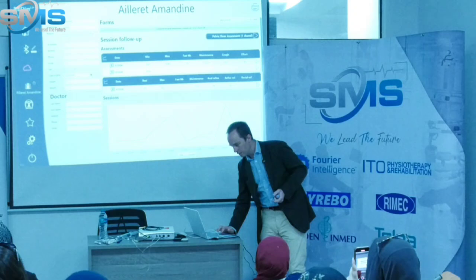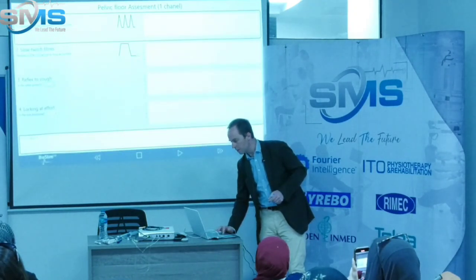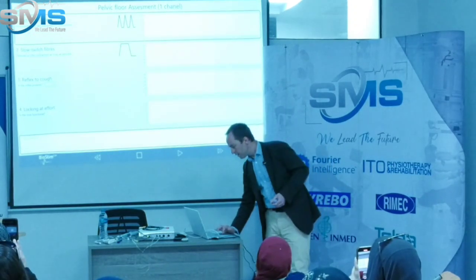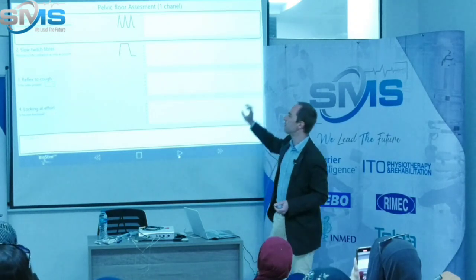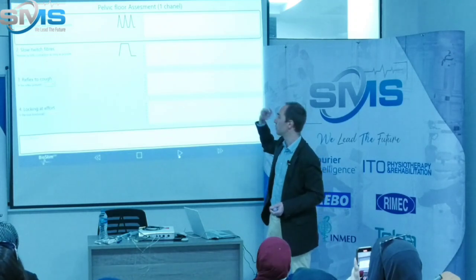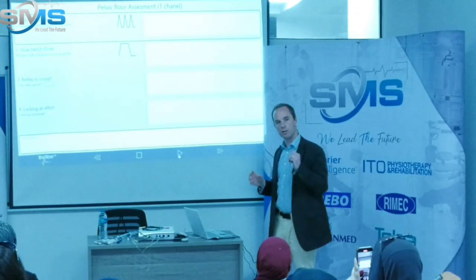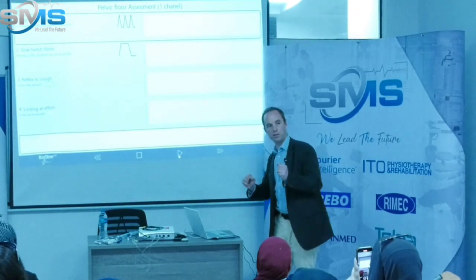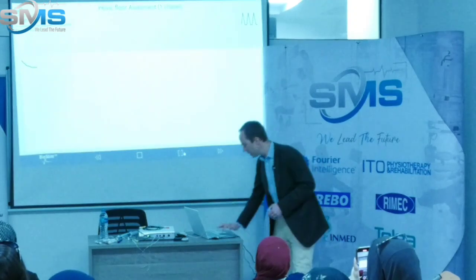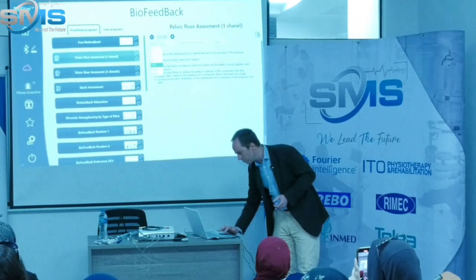so now I can start to work with my patient. So the first thing we'll do is an objective assessment. You can see it's very easy. It will take 1 minute. We'll test 4 different things. The first one is, are the fast fibers working correctly? The second one, slow fibers. The third one, is the reflex present? And the last one, can the patient lock her contraction and move? So that's what we'll do. Sorry, mistake, I didn't select a good peripheral.